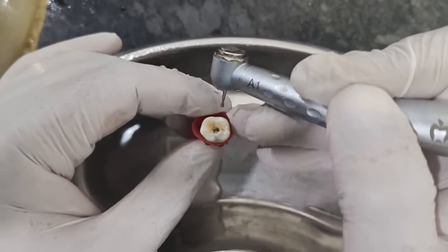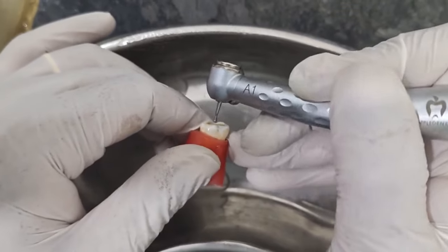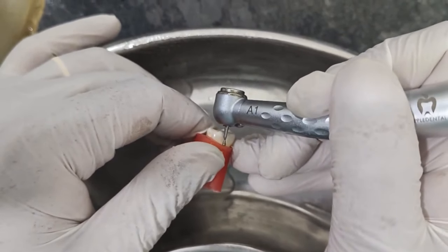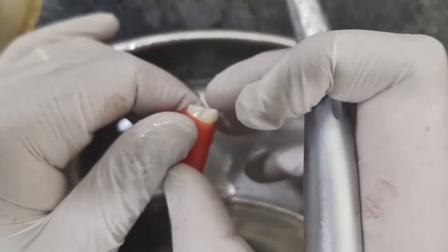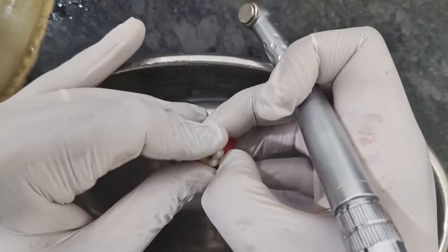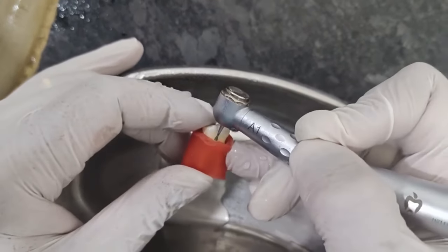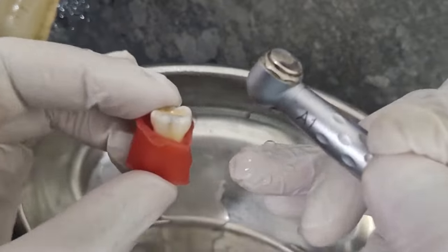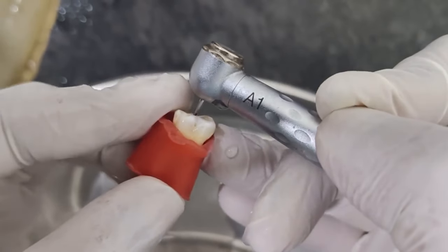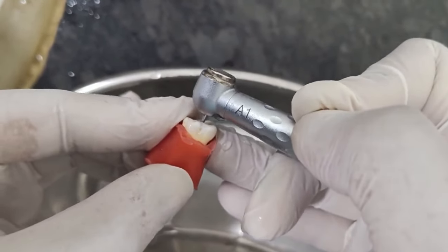So we should not actually totally put the burr inside. We only have to put the burr till the cemento enamel junction of the tooth, as I have shown in part 2 of the video. If we remove the wax, I can show you the cemento enamel junction over here. So this is the cemento enamel junction, this place. You can see how much length it is going inside. We should not go deeper than this.